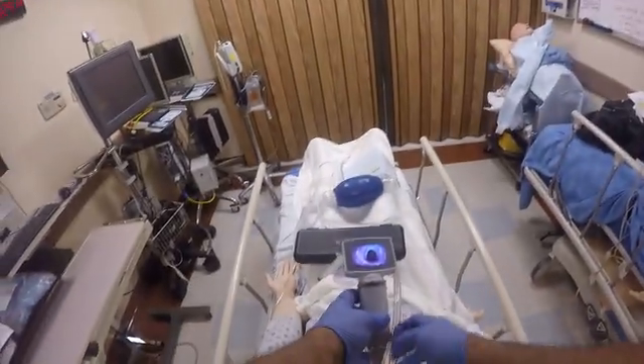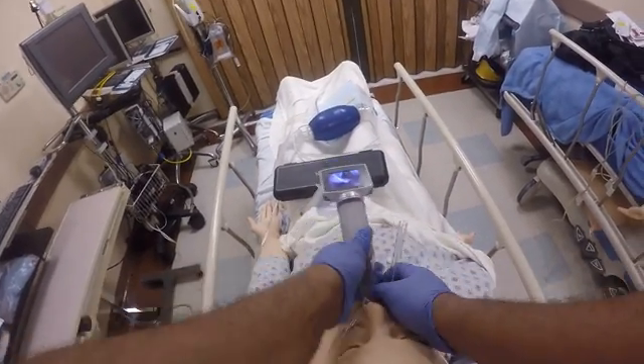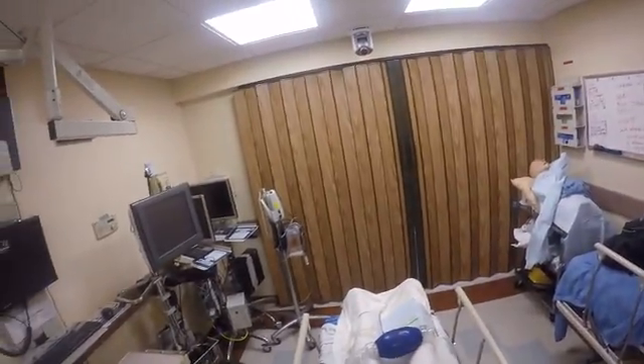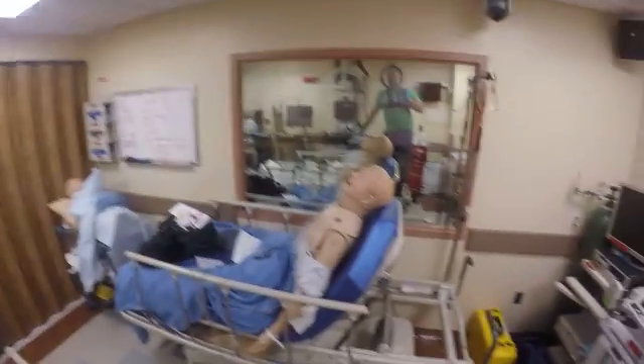I see something — what do I see? I think I see something. The tube is going in. It's amazing how people are going to ask me to confirm placement. Now I need to confirm how deep it is: lip line 21, 22. It's possible. For those who think it's impossible, it's not. Getting up on top of the patient, intubating from above. If I were six foot five, six foot six, or even seven foot, I'd actually consider intubating patients from this position.